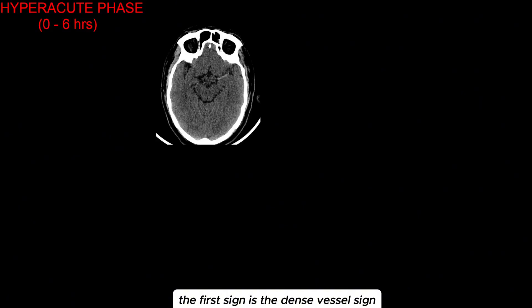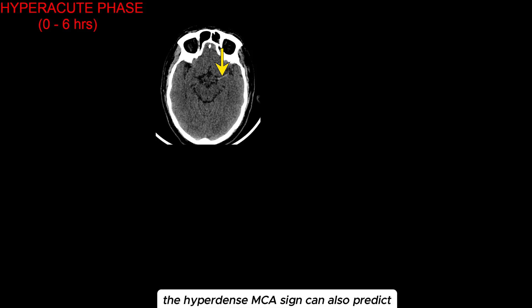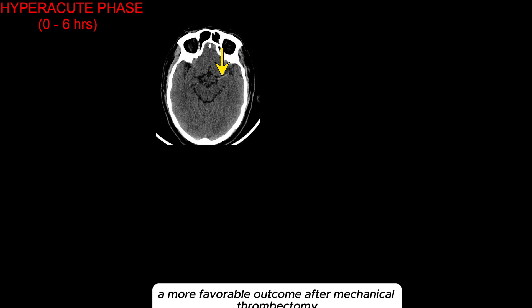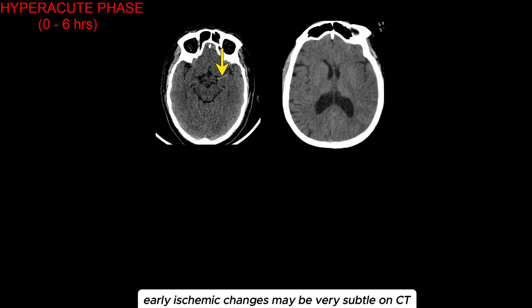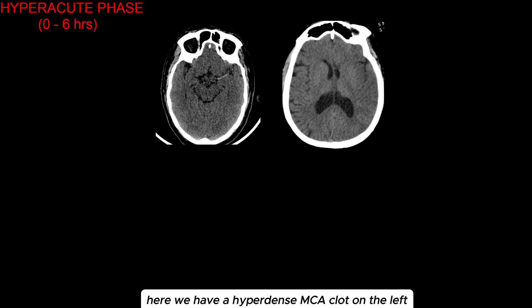The first sign is the dense vessel sign. This represents the clot itself, which usually has a higher content of erythrocytes, giving it a more hyperdense appearance on imaging. The hyperdense MCA sign can also predict a more favorable outcome after mechanical thrombectomy. Early ischemic changes may be very subtle on CT, so always use symmetry to help spot small differences. Knowing the symptoms will guide you towards the affected area. Here we have a hyperdense MCA clot on the left.